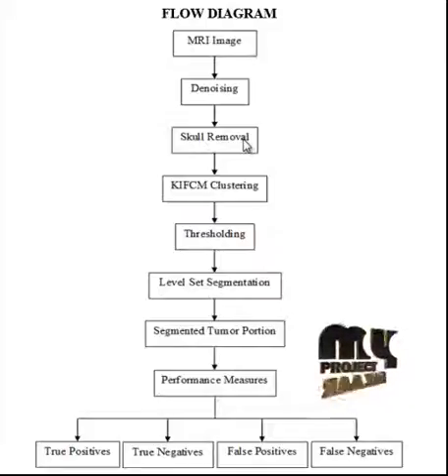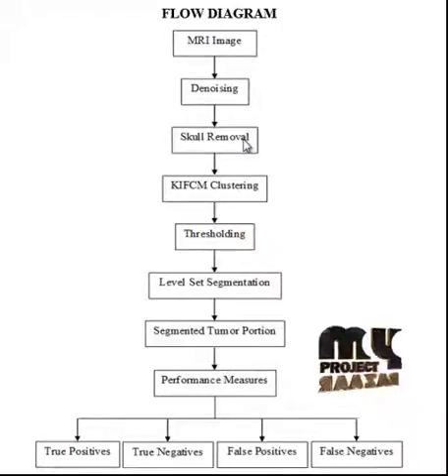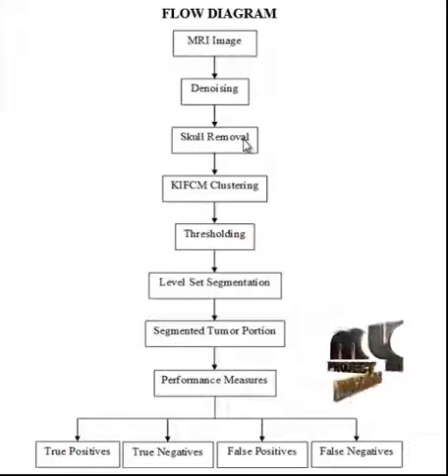The structuring element is a small binary image, that is, a small matrix of pixels, each with a value of zero or one. The matrix dimensions specify the size of the structuring element.